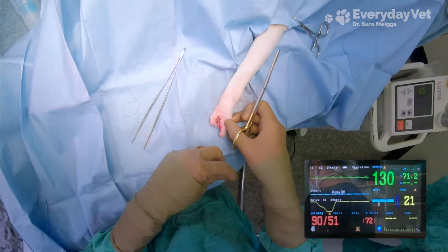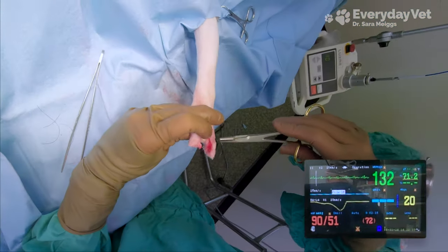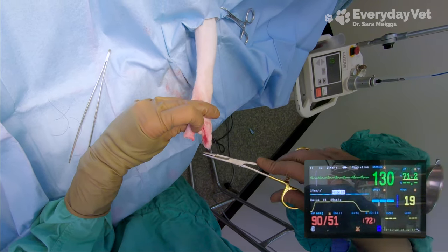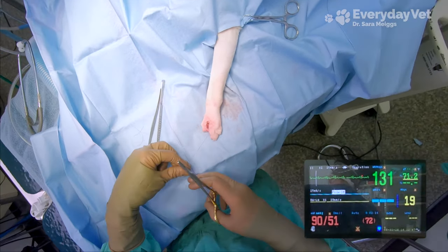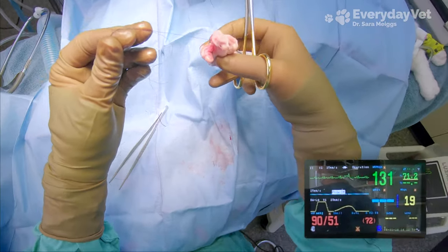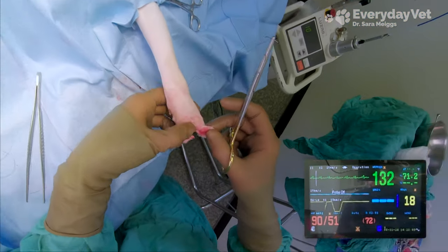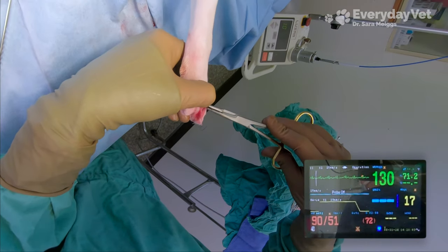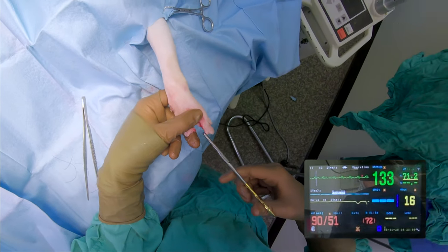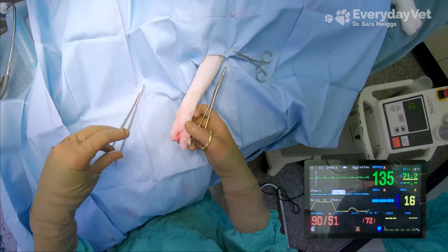Now we're back at our next blood pressure reading, and as expected, that last reading was much, much higher than what we're looking at now. We're at 90 over 51 with a mean pressure of 72 — pretty consistent. We're running a little bit higher than we were for the rest of the surgery, but I'm not surprised. I'm suturing the toe up and he doesn't need to be kept as deep on the anesthesia, so my assistants have already lowered that inhalant gas in preparation for starting to wake him up. It's normal for the pressure to go up a little bit. The diastolic pressure is still kind of borderline low, the mean is not hypotensive but not super high, and the systolic is appropriate at 90 — so I'm looking at a normal blood pressure reading given the past readings we've had. This number I believe; the last one, not so much.